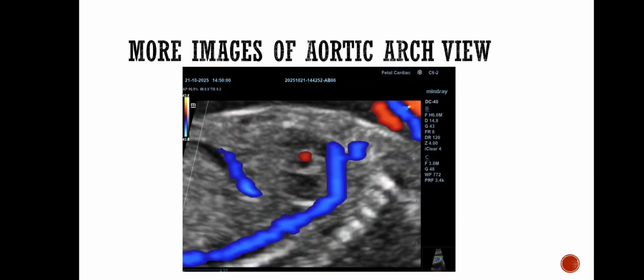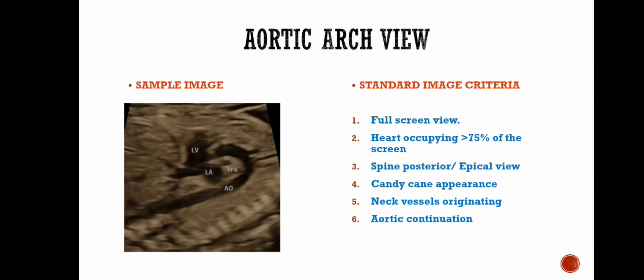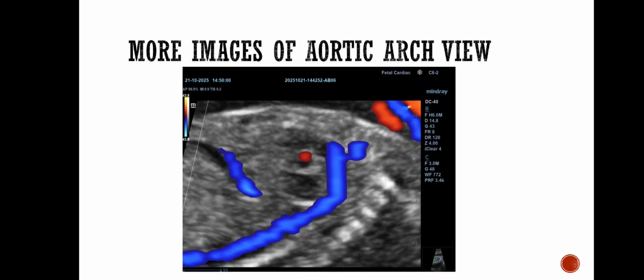These are more images of aortic arch. See neck vessels originated from the arch.